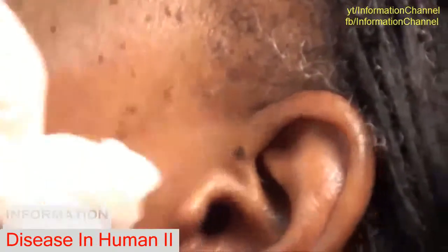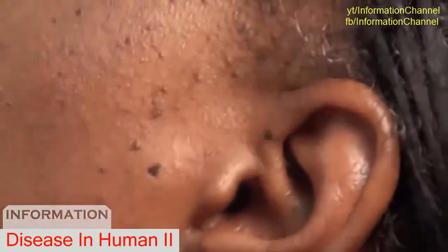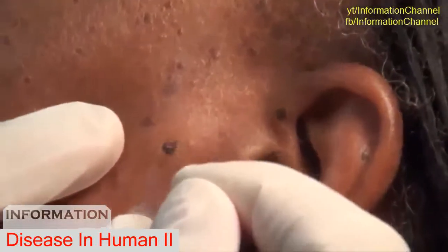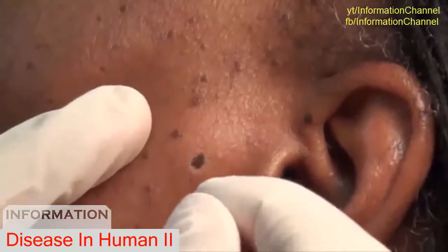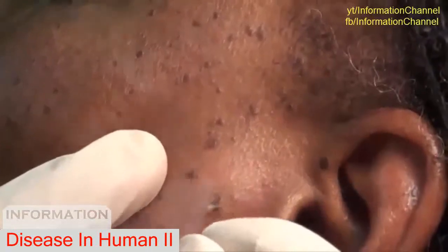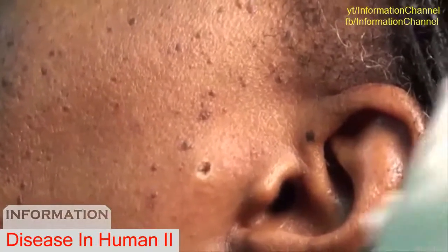A little bit. I'm going to flatten it out, but that pigment goes pretty deep. I'm going to see if I can get some of it out of there. It's about as deep as I dare go. I can tell you that this one has pigment that goes so deep that I'm never going to get the whole thing out without making a scar, and I probably already went deeper than I preferred to.